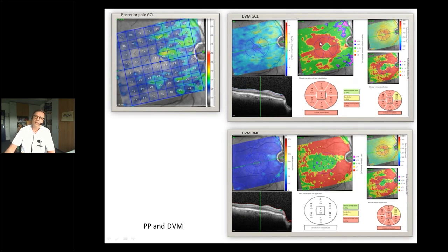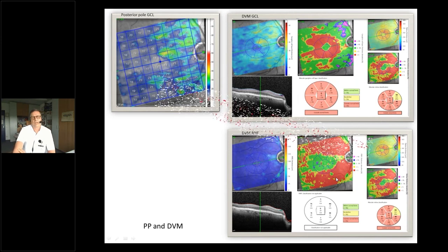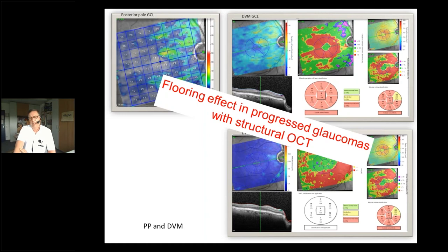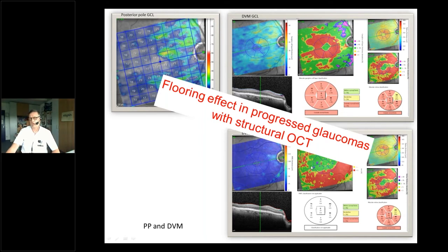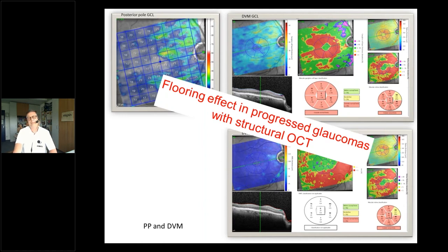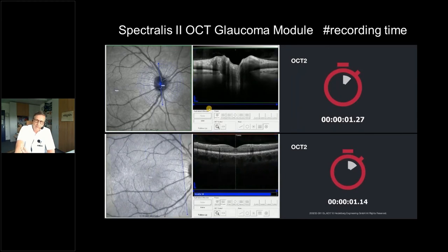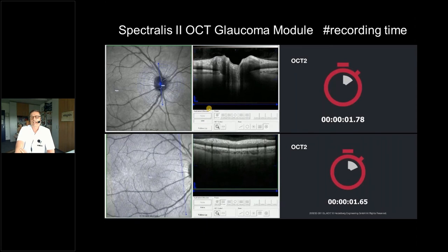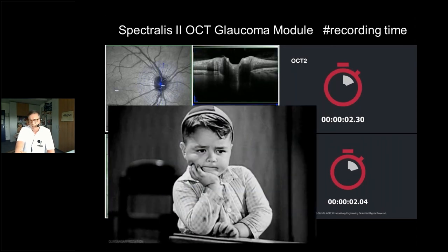The deviation maps show pronounced ganglion cell loss around the fovea and pronounced RNFL loss — confirming the flooring effect. In far-progressed glaucomas I stop doing nerve fiber layer thickness measurement and BMO-MRW, and instead look more at visual field progression. I also still use the HRT with TCA, which flags progression nicely even in advanced stages. Acquisition time is a challenge in a very busy clinic.